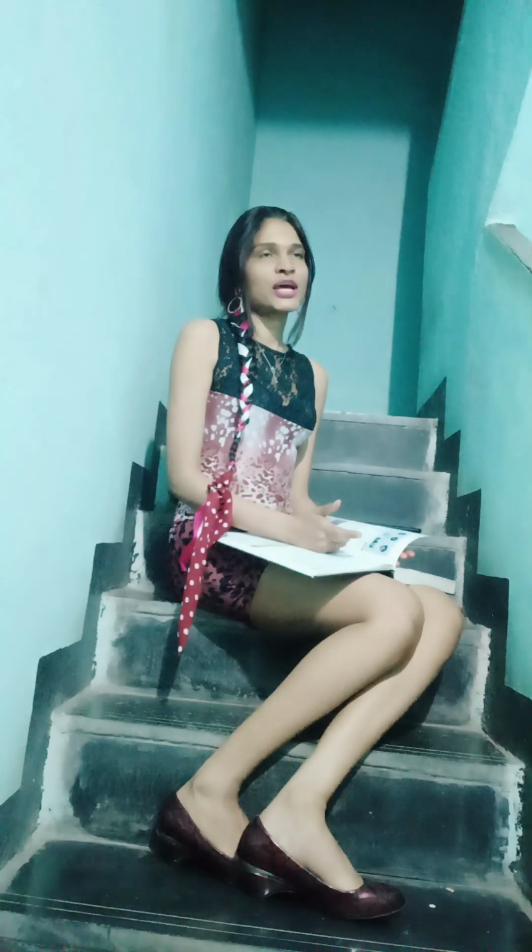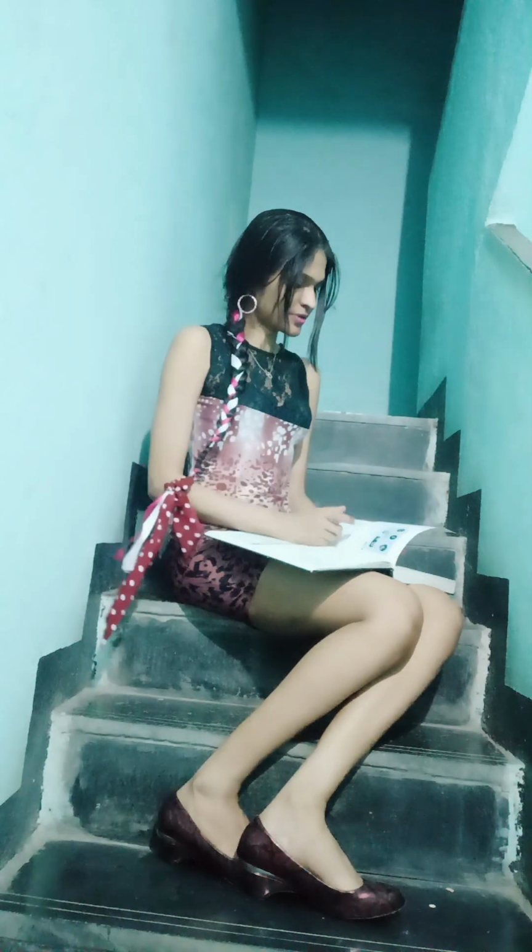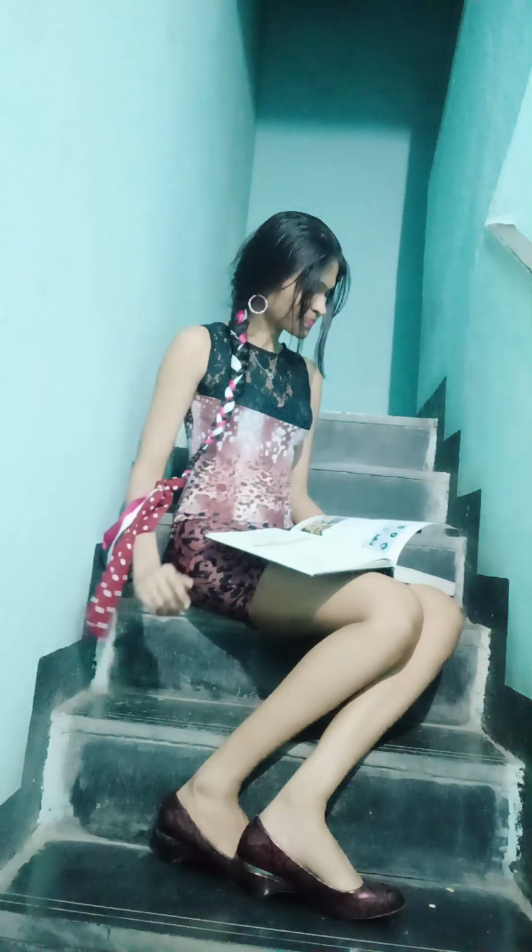And then after that, the patient is positioned at the slit lamp. The lids are retracted. The patient is asked to look upwards, and then the lens is positioned. First the upper curvature and then the lower curvature. First the upper edge and then the lower edge of the lens. Make sure there is no air trap, because it interferes with the visualization.